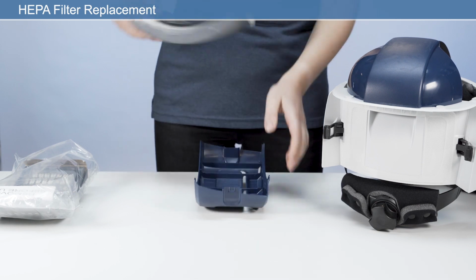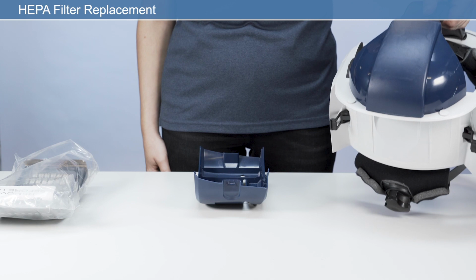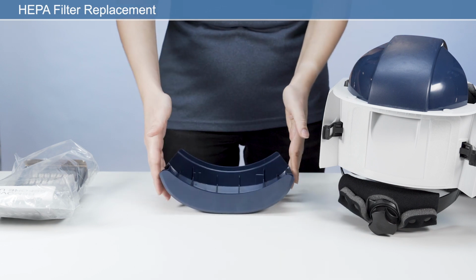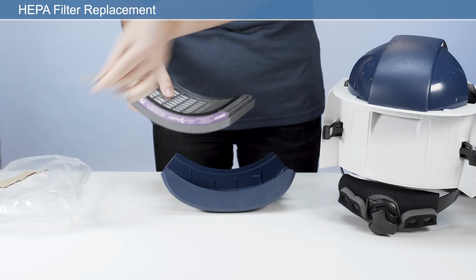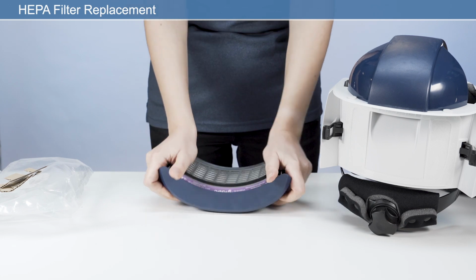Please dispose of the used filter responsibly. Be sure to not allow any dirt or elements which may obstruct the airflow to enter the air inlet whilst replacing the filter. Insert the HEPA filter correctly into the filter cover housing with the filter label facing upwards. Refit the filter cover into its original position on the respirator.